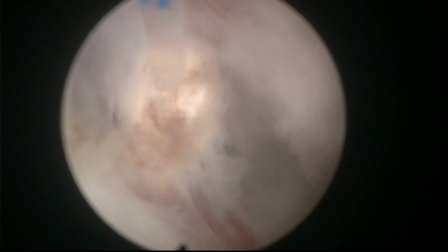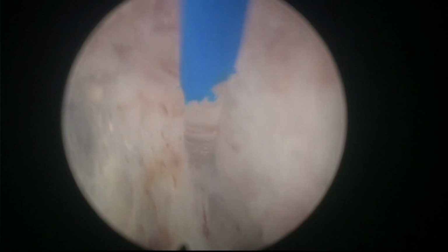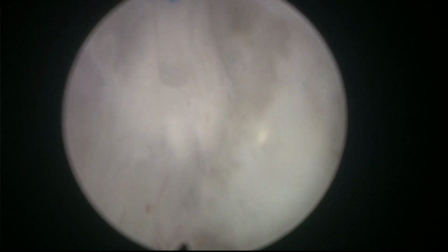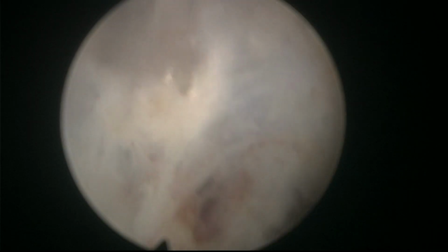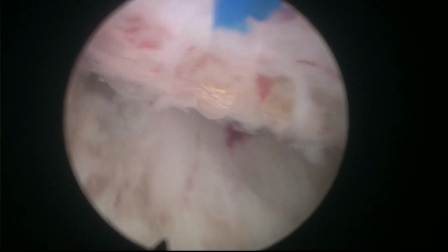So here, again, you see, if you follow the middle lobe, it looks like the plane is coming this way, but then the lateral plane is going much more lateral. So I like this concept of the ligament because it warns you about this possibility. So when you find it, you're not confused, and you're not thinking that there's something wrong with you. It's the anatomy of the adenoma.